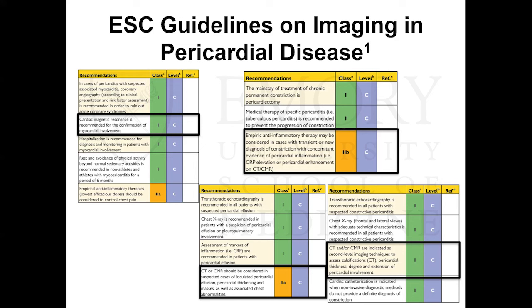Whenever you sit there and you look at these guidelines a little bit more closely, it wasn't abundantly clear to me what exactly the cardiac MRI was adding in our management and diagnosis. Certainly, it can identify things like myocarditis. We can certainly see things like hemodynamics, but a lot of that stuff in many of our patients we already have. So we really wanted to figure out why we would get a cardiac MR and what it's really adding, particularly before we order a study that's not as commonly obtained.